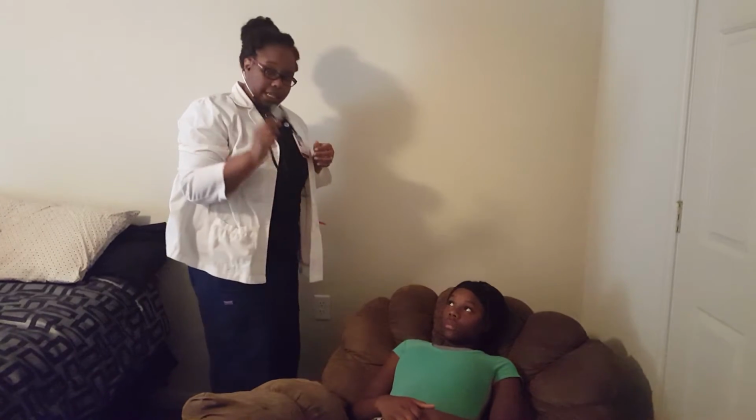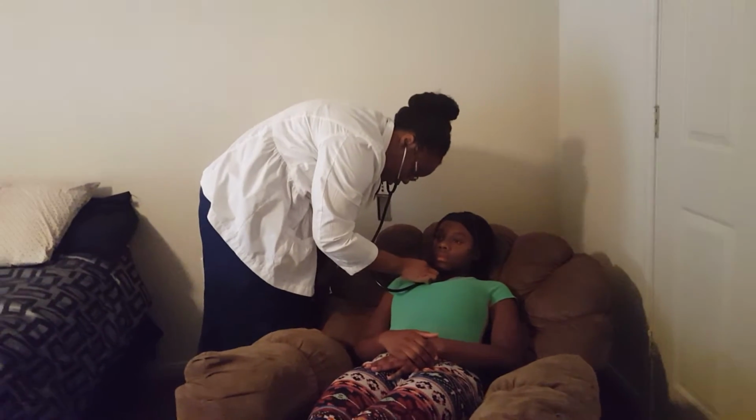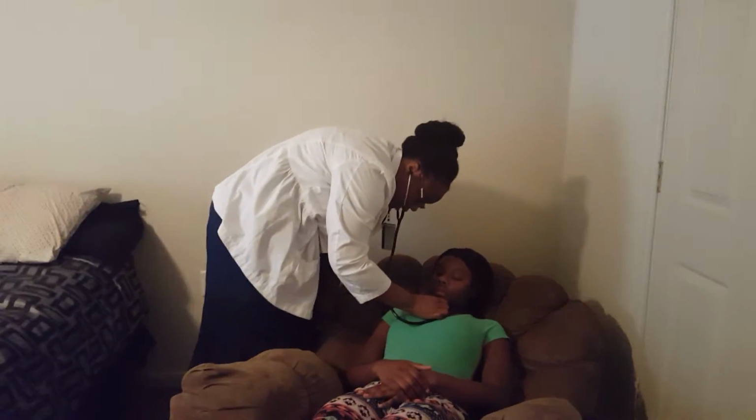I would listen to the heart sounds with the diaphragm of my stethoscope, making sure that I have my opening turned to the right side where I can hear. You can test your stethoscope with a little tap. And I'm gonna listen in the aortic area, second intercostal space, right sternal border. The pulmonic area, second intercostal space, left sternal border.